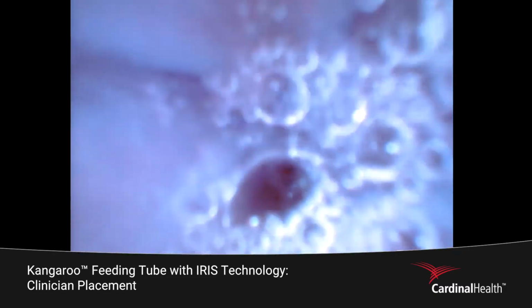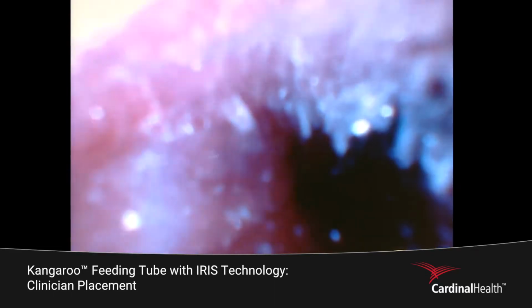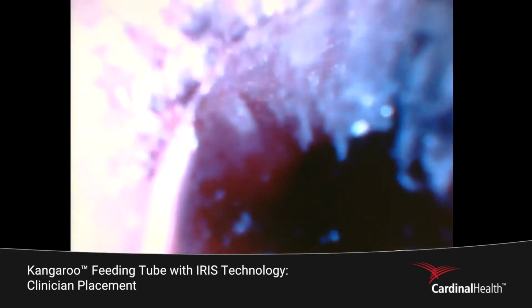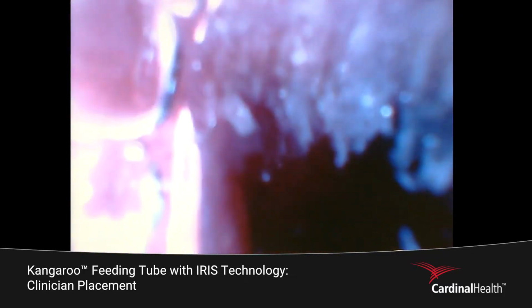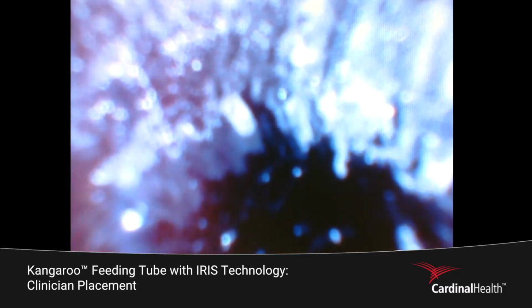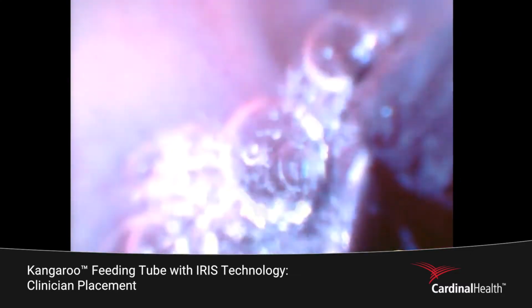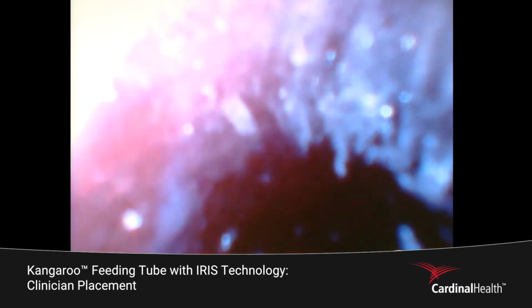So right now we're looking at the esophagus. You can see it closing and opening. Put a tiny bit of air in. It's really good views of the upper part of your esophagus, and I'm advancing really slowly. And then as I walk closer, I'm gonna enter your stomach.